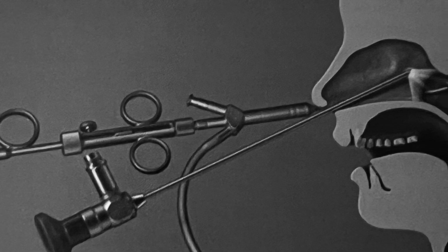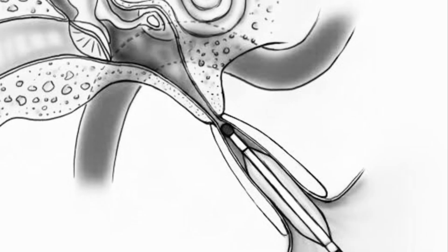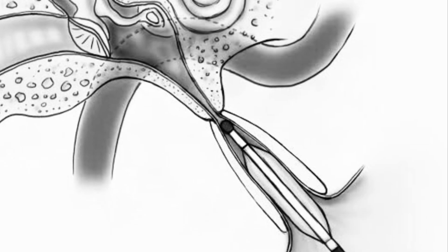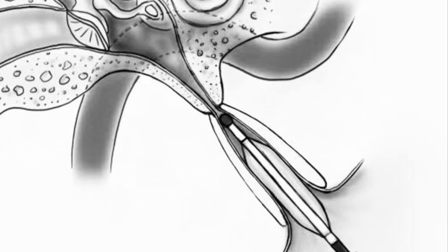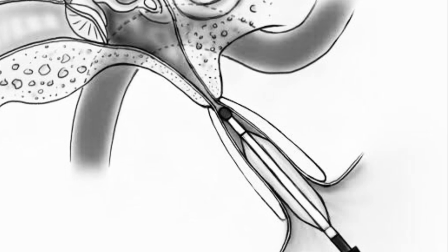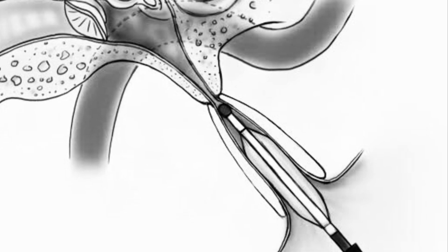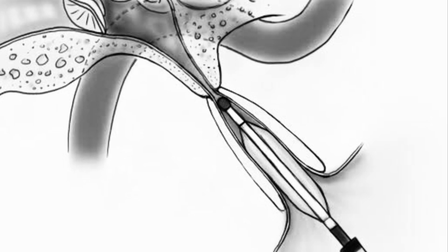Before performing BDET, a thorough evaluation is essential, including clinical history and exam to assess symptoms, tympanometry to confirm abnormal middle ear pressure, nasopharyngoscopy to examine the Eustachian tube opening, audiometry to evaluate hearing function, and imaging like CT or MRI when structural abnormalities are suspected.